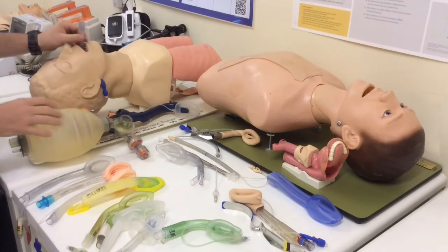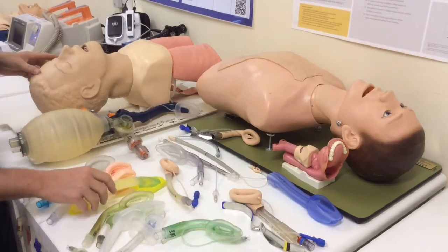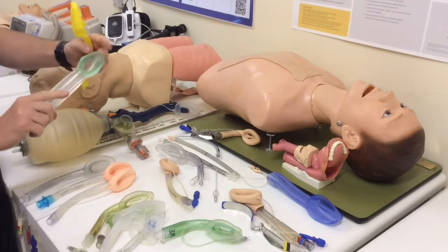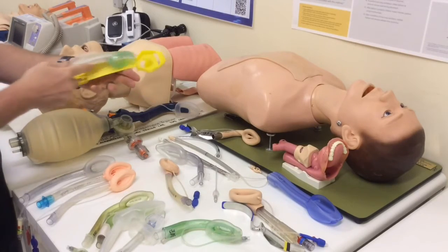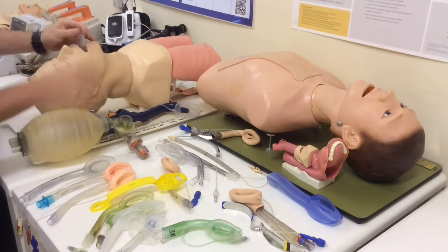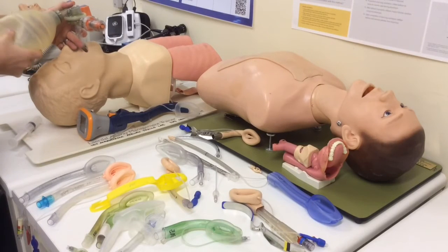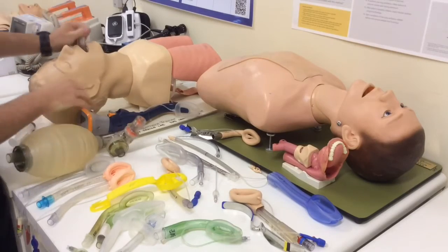Now, some of the newer devices, many of the second generation devices, have more rigidity to them. So for instance, here's an iGel. Again, it's got gastric drainage, so it's a second generation device. You can put some lubricant onto the little frame it comes in, lubricate it nicely, and because this device is a little bit more rigid, I can again insert it, voila, and it goes in. iGel, of course, doesn't have an inflatable cuff. It's gel, it molds to the shape of the patient's airway, and now I can ventilate, and off I go.